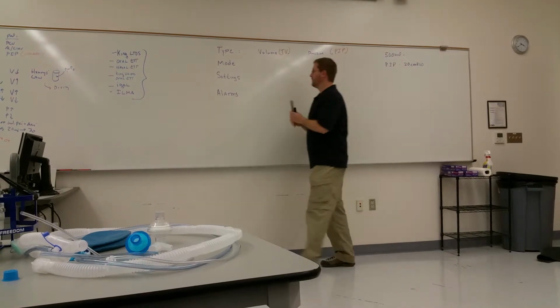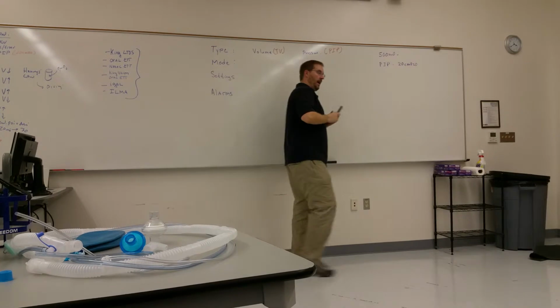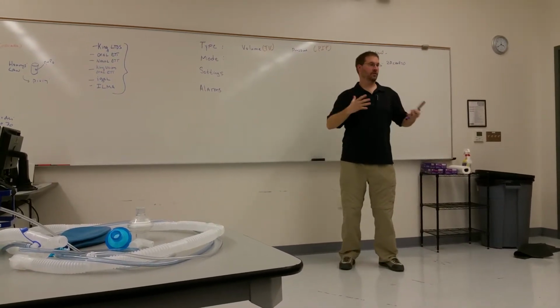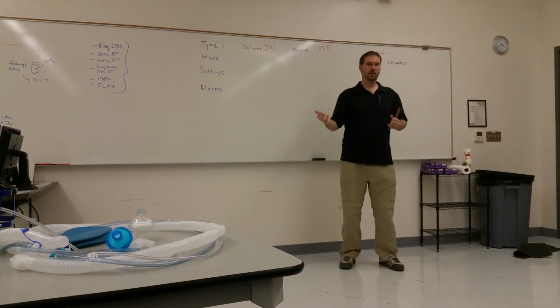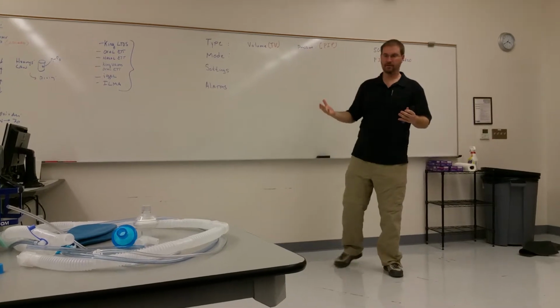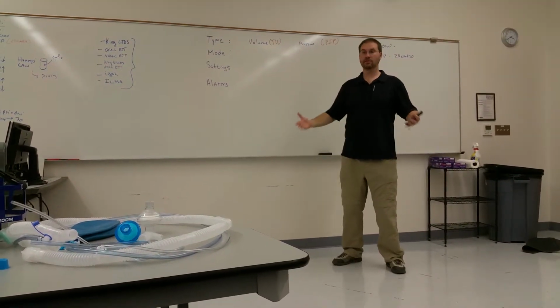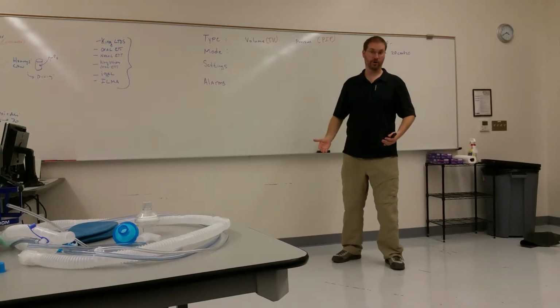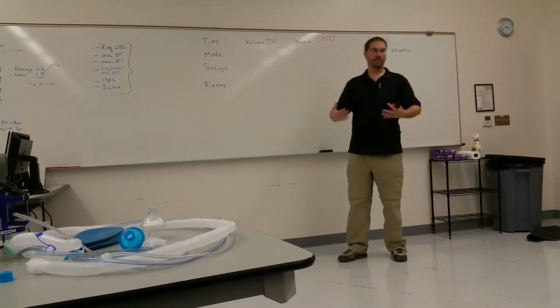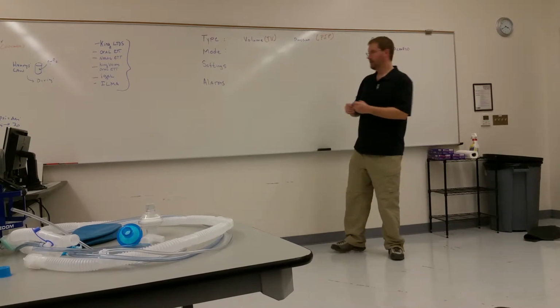Now, the next thing that we have to talk about is the mode of ventilation. The mode of ventilation is how the ventilator and the patient interact. How do they talk to each other? So, if my patient is completely unresponsive and apneic, does mode matter? No. Doesn't matter a bit, as long as it's a mode that can provide full support. Is everybody okay there? The only time mode matters is when I have a patient that's actually taking spontaneous breaths and interacting with the ventilator.